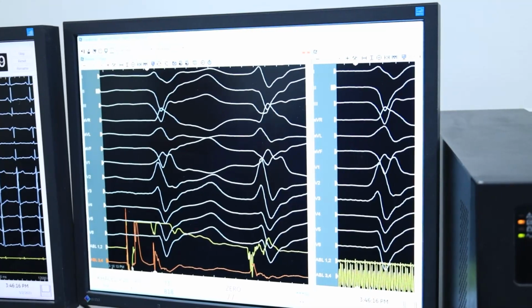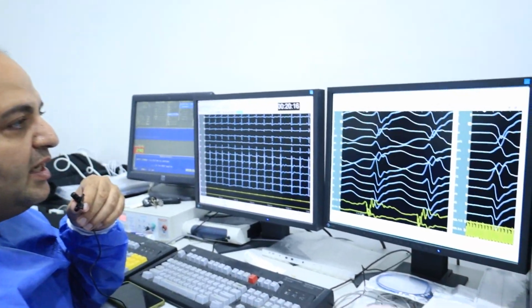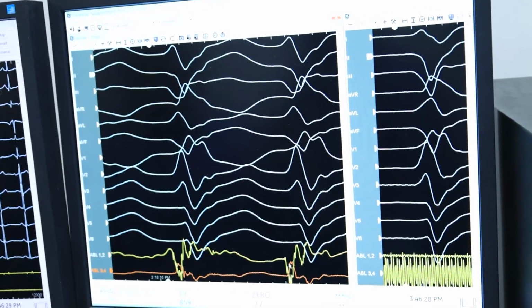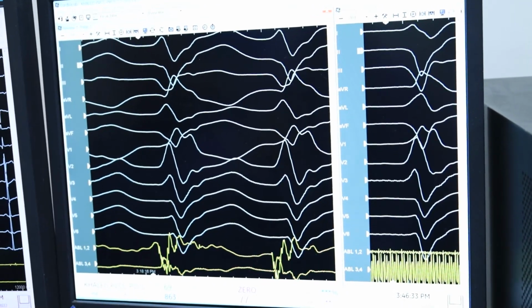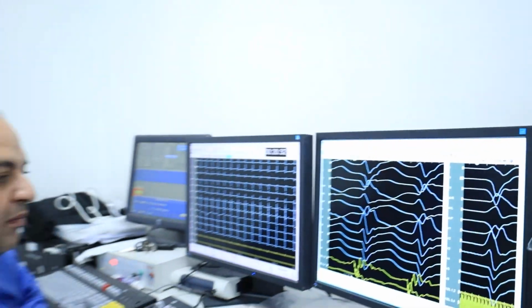And immediately after ablation, the clinical PVC is gone, and the only thing present is the firing during ablation. Yes. And this is catheter induced. As you can see, the very spiky potential comes directly from the catheter location. This is the catheter bumping in the same area.